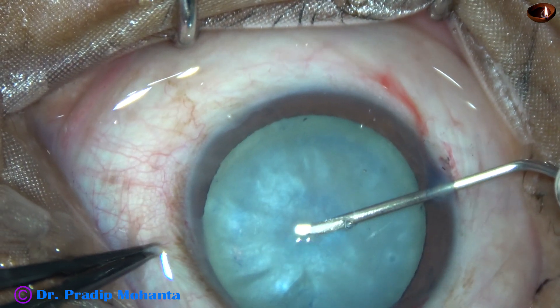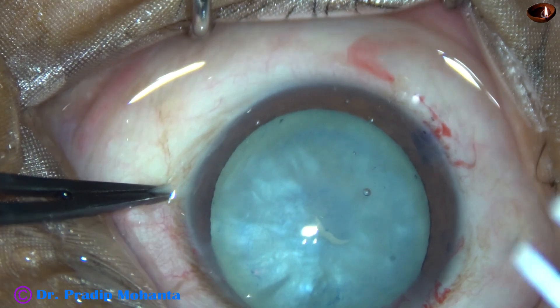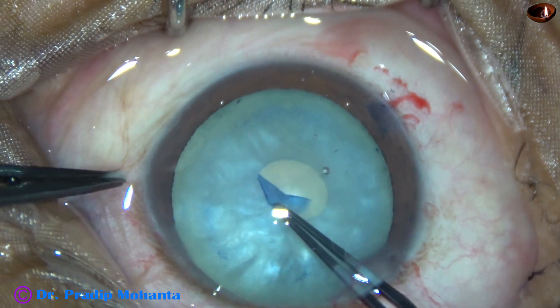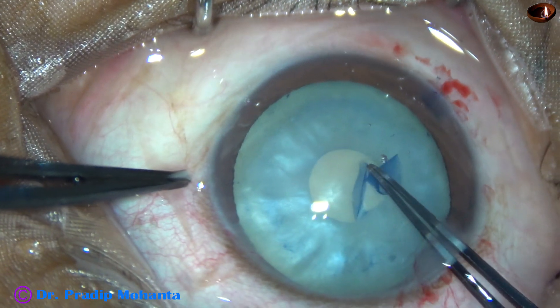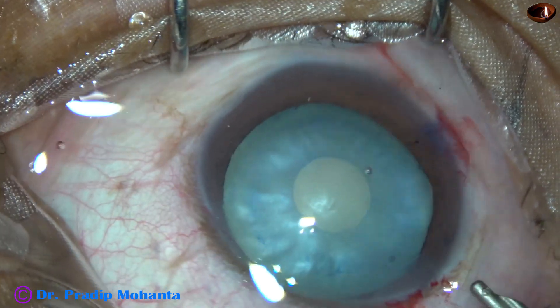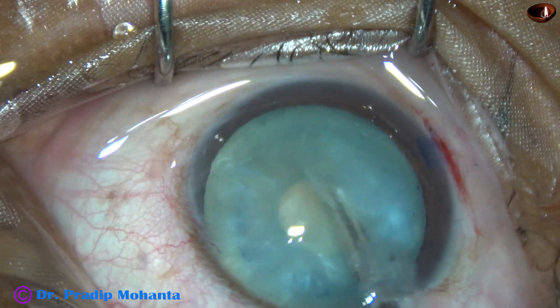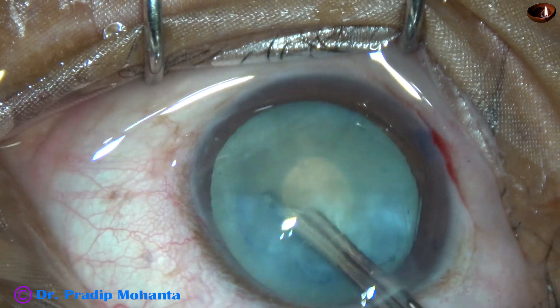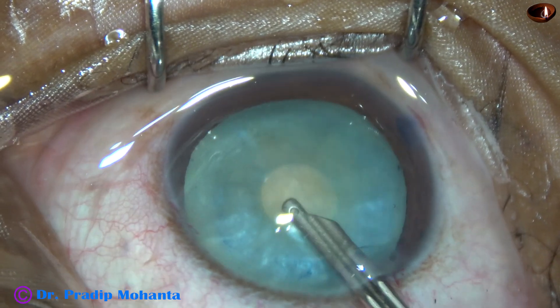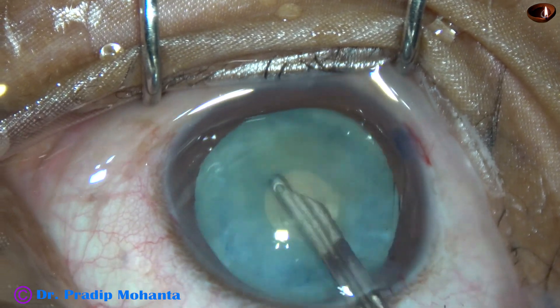Today I did two consecutive intumescent cataracts. This is the first one. After staining the anterior capsule with trypan blue dye, capsulorhexis is being done at this moment. I always do a small rexis first — this can be called momirex, Mohanta's minirexis. Then I aspirate some cortical lens matter through this small opening to reduce the intralenticular pressure. When we aspirate some cortex through this small opening, the intralenticular pressure gets reduced drastically.